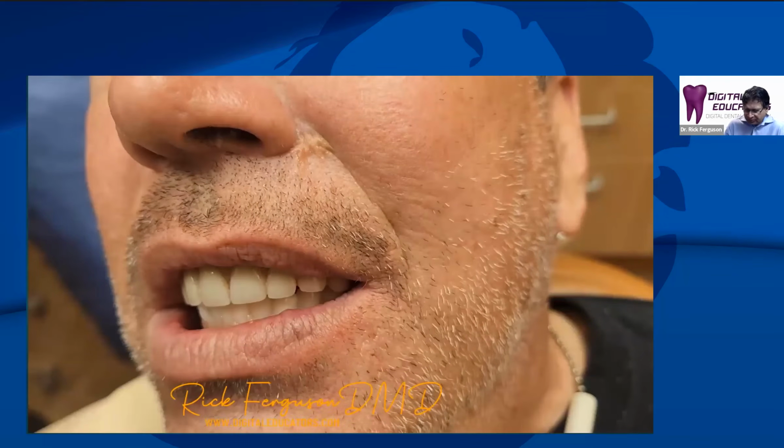What I like about these printable prostheses is that it's all one piece, and we make them fairly thick so that they're not prone to fracture. But we leave these in for about 5 months. We don't touch these. They leave the day of surgery with a prosthesis like this. And it really helps stabilize the implants and allow them to integrate properly. And this is our standard modality for doing this now. So we're doing this in our clinical practice. We're also doing this at the clinic where we run our implant continuum.